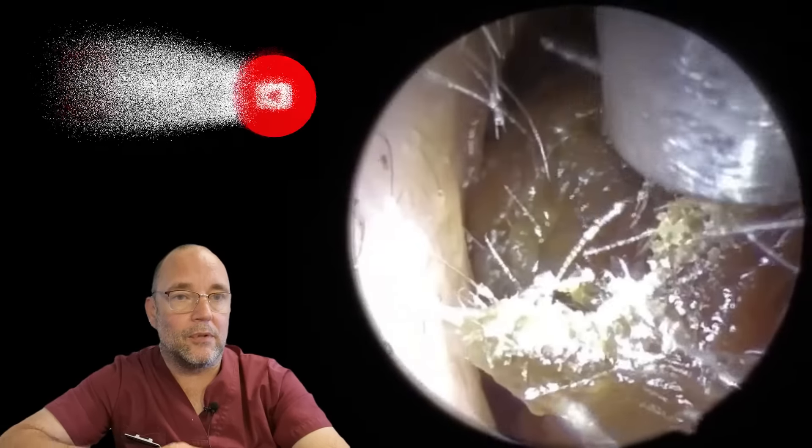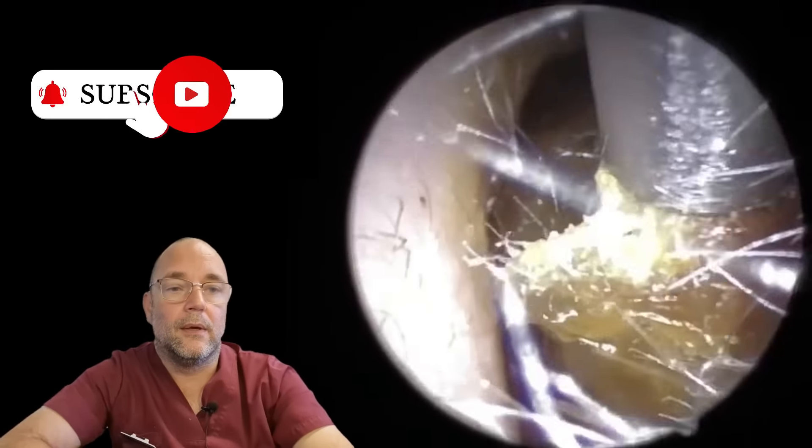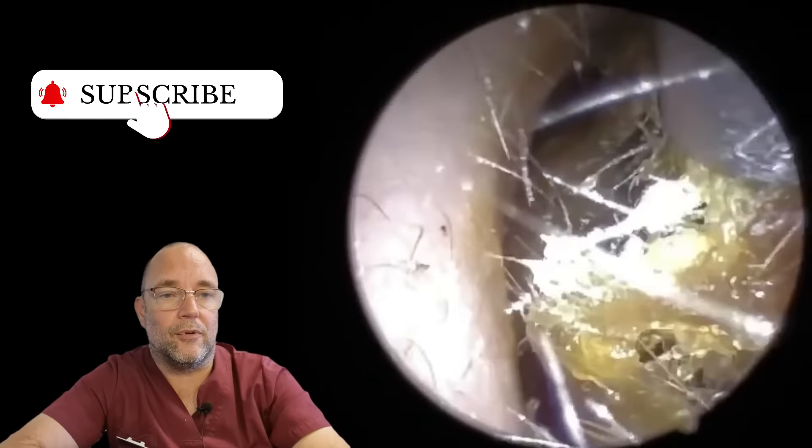Now, as you can see, it's a bit of a mess, isn't it? And you're probably wondering what's going on there, as was I, but I will explain that as the video goes on. Like I said before, I can obviously have a very good idea what's going on. It's not my job to formally diagnose these things, but I can certainly point the specialist's ear, nose and throat in the right direction as to what I think is going on from what I know about the patient.